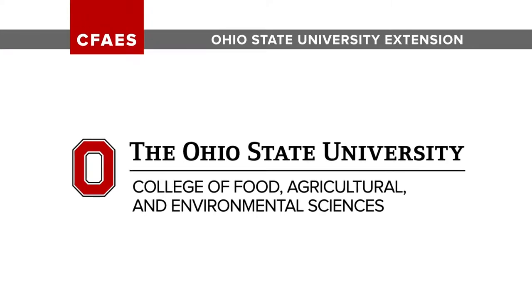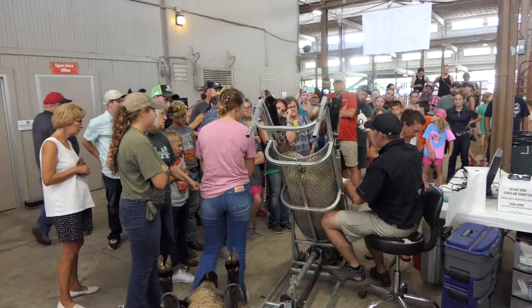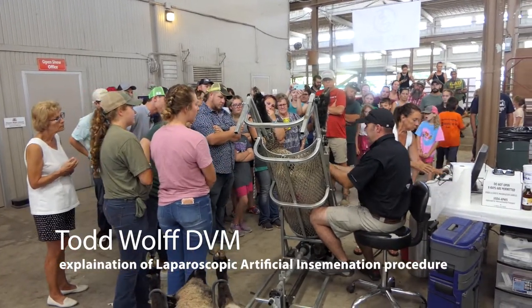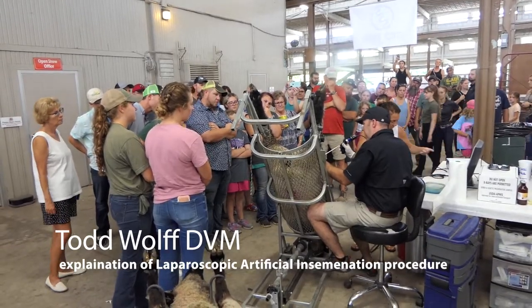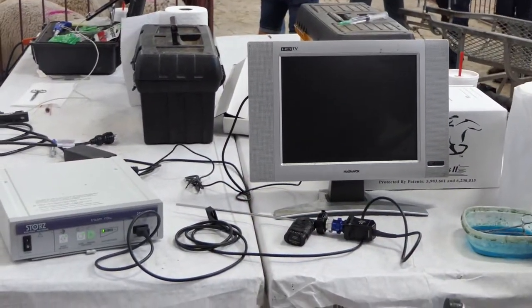Welcome back. Today we're going to talk about laparoscopic AI in this video. The veterinarian we're working with is Dr. Todd Wolfe, and he'll explain the procedure as he moves through it.